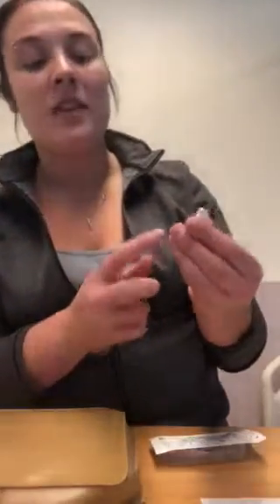And so I'm going to get started, and I'm going to prime my tubing with my morphine. So I have my morphine here. I don't have a label on this one, but just for the purpose of this demonstration, I have morphine 10 milligrams per 1 milliliter. And I know that I have 0.96 milliliters in this tubing, so I'm going to prime the line with my morphine. So I'm going to wash my hands.